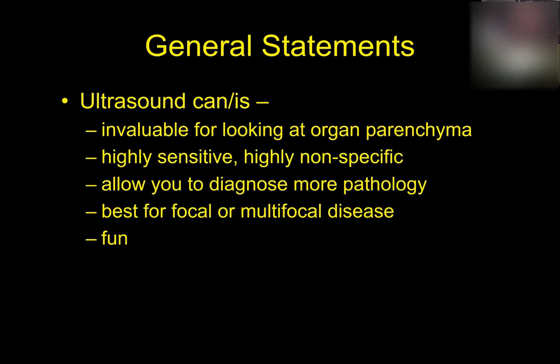On the other hand, we said when we talked about radiographs that radiographs cannot look inside the organ. So I can't tell you anything about the parenchyma within an organ. If you had a mass inside the liver or spleen, unless that mass was so big it's bulging the capsular surface and distorting the shape of that organ, you will never see it on radiographs.